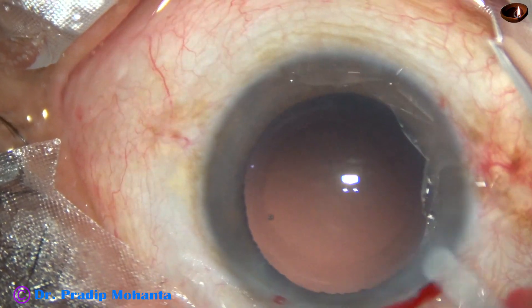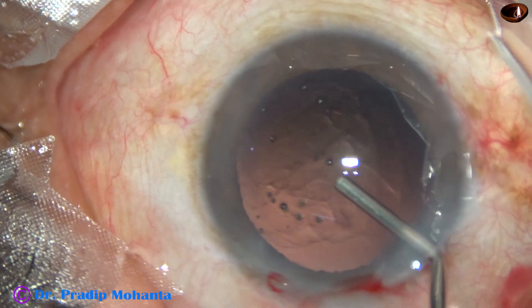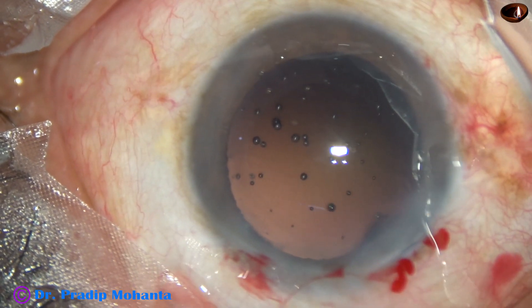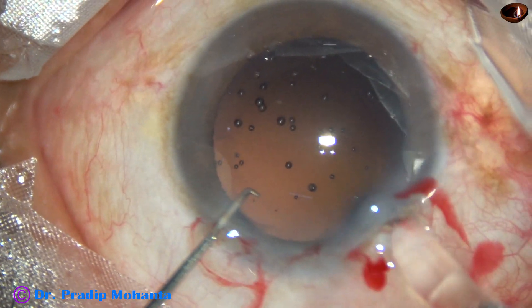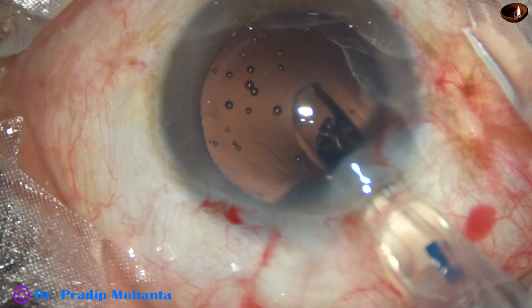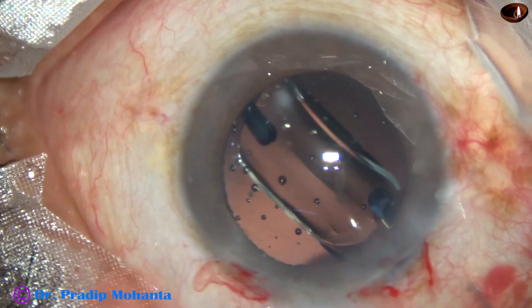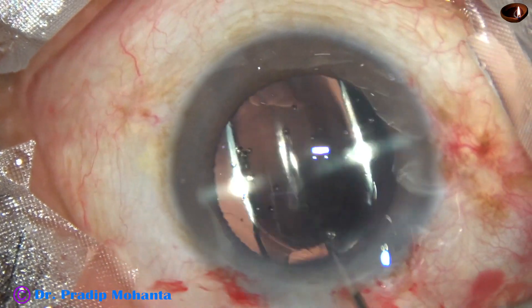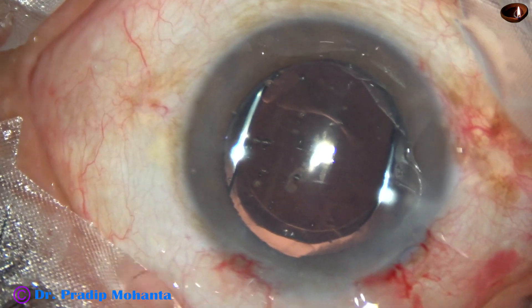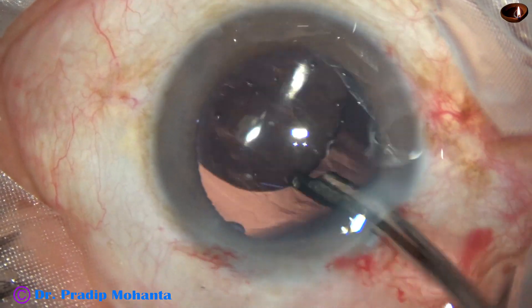Nucleus, epinucleus, and cortical cleanup is done very nicely. Now 2% HPMC is injected to fill out the capsular bag as well as the anterior chamber. We have selected the Hoya ON50 intraocular lens — a beautiful pre-loaded system. The lens is delivered by screwing the piston and placed 180 degrees. The haptics are placed about 90 degrees away from the main incision so that I can go behind the optic for visco clean-up.